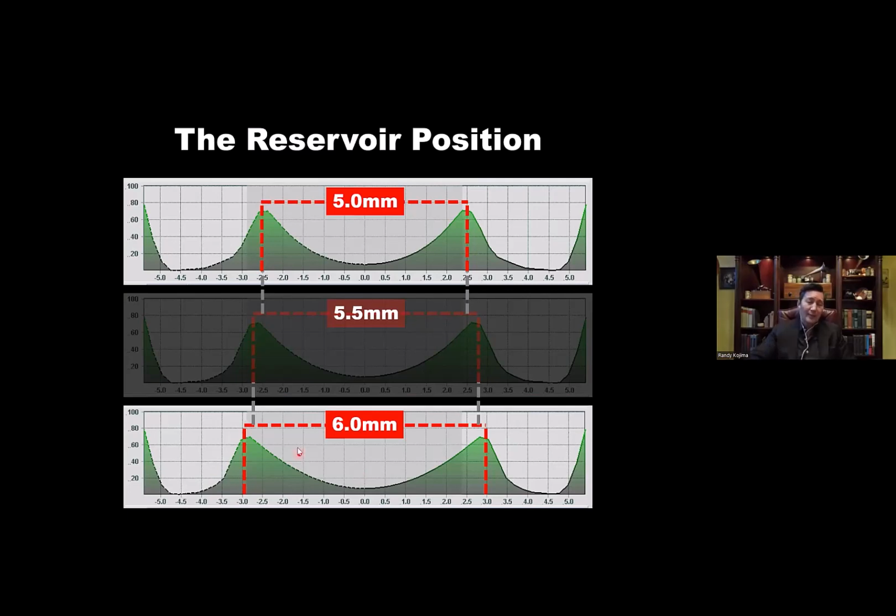So the novel lens is a 5 mm OZ, and what you might see is the peak of the reservoir, the deepest point the fluid layer reaches, is closer to the center of the eye. So you're basically squeezing down, peak to peak, the highest point of the fluid layer and the resultant suction force. So you're comparing a 5 mm optic zone in some of the kids to a 6 mm optic zone in other children.